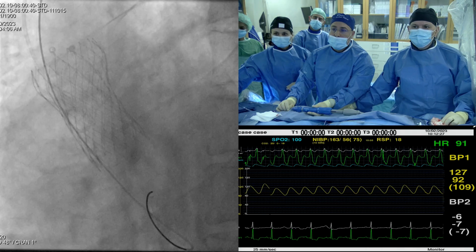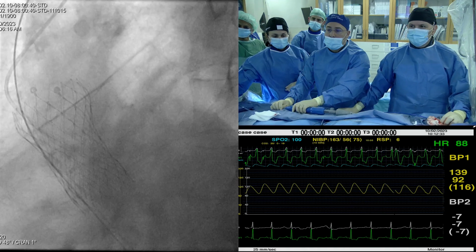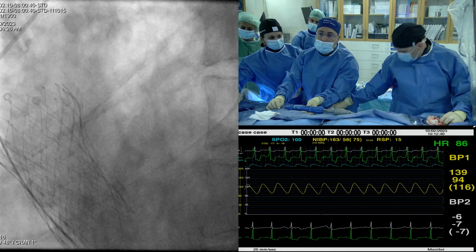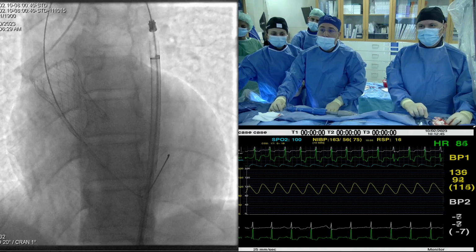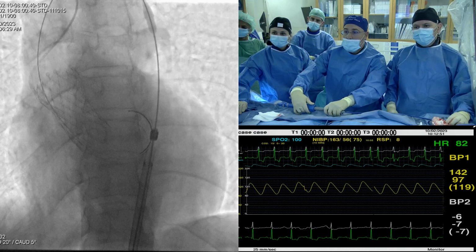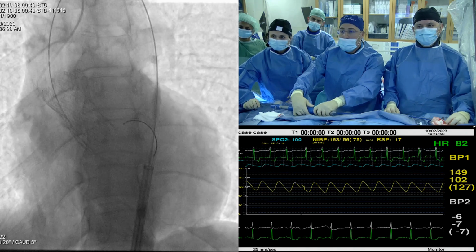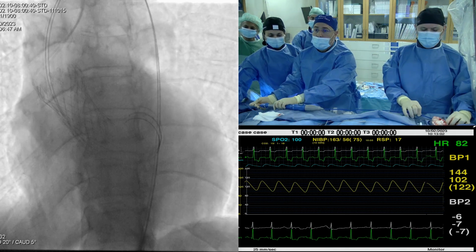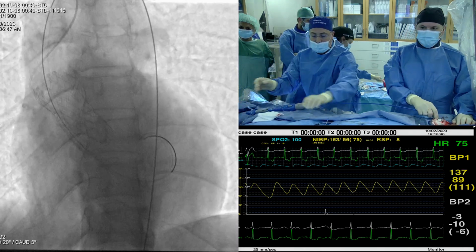Usually no, but I can understand the logic behind it. This is actually a good point, Dr. Seth, that some people mentioned to me. I was having this conversation with the engineers at Medtronic, right? If the valve is still connected to the catheter, you can leave it there as long as it's not going to expand beyond a certain point because it's prevented by that connection. So what we do all the time is go very, very slowly in the final deployment to give some time for the nitinol to progressively expand.